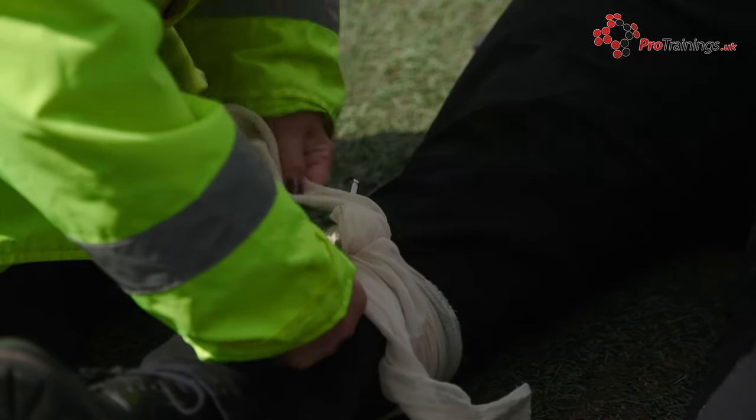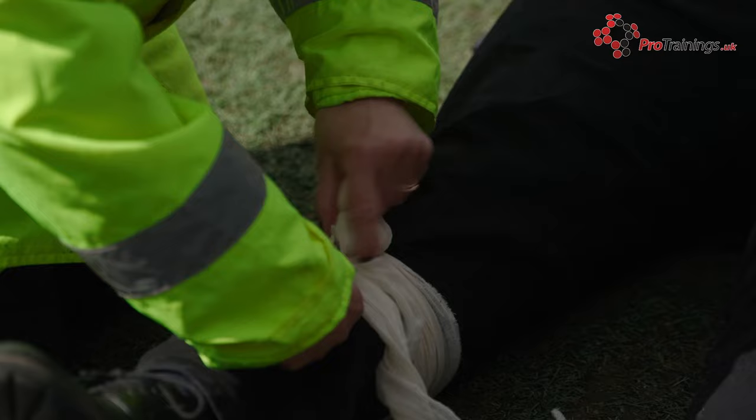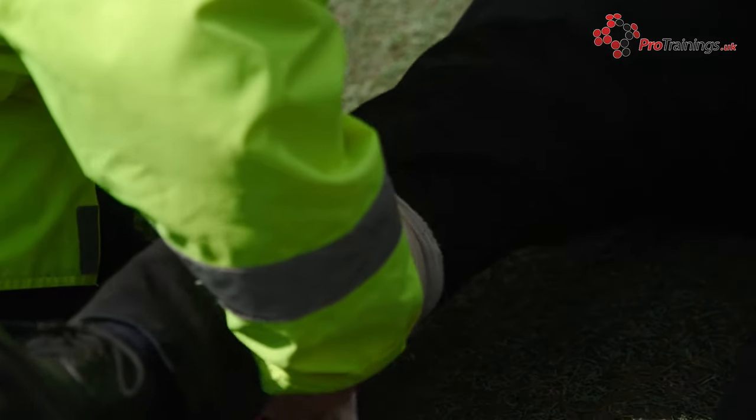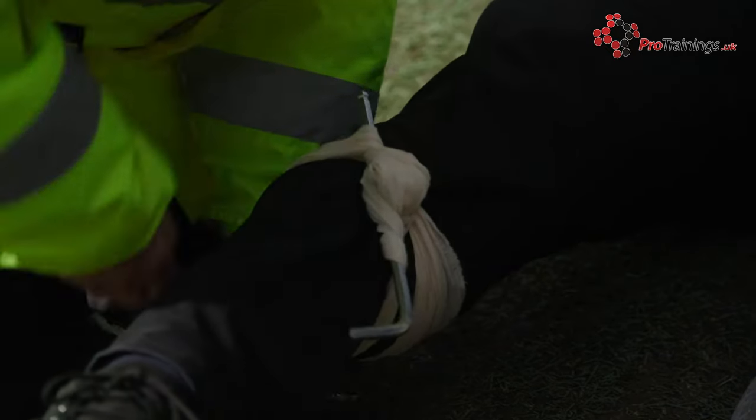This is going to hurt, but it will stop the bleeding and it is vital we get this done as soon as possible to maintain as much blood in the body as possible. Once it is tight, tie off the ends to hold it securely in place.